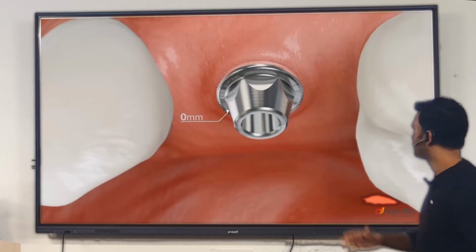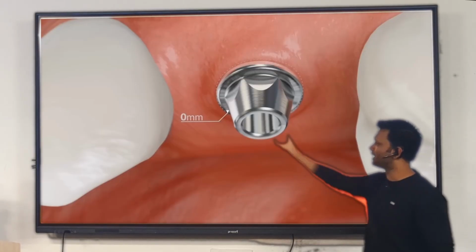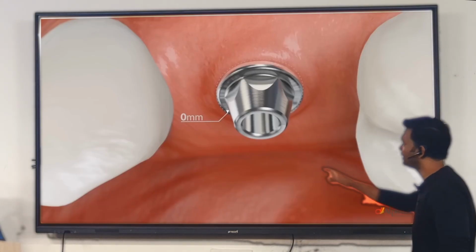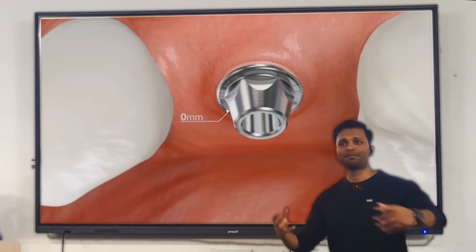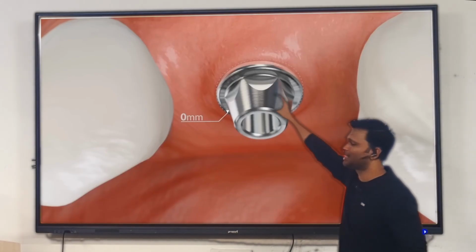Okay, next. So continue. So you're going to place the abutment in the site that is prepared for receiving the prosthesis. Okay, the collar was formed and we placed the abutment. This abutment was prepared in the oral cavity. Now the first method is you just place the abutment just like FPD. इसका impression ले लो. So on the stone you're going to get this shape.